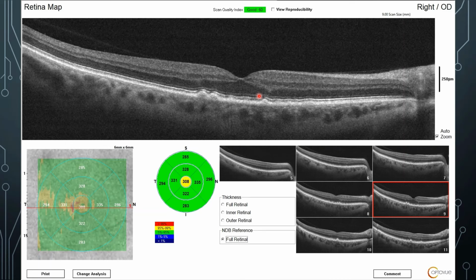So, in any case, that gives you an idea of what little drusen look like on the side through a cross section. And it's also telling us here, if we mapped out the thickness of this tissue all the way around, that the center is thicker than it should be because of these drusen deposits. And that also shows up on this map here too.